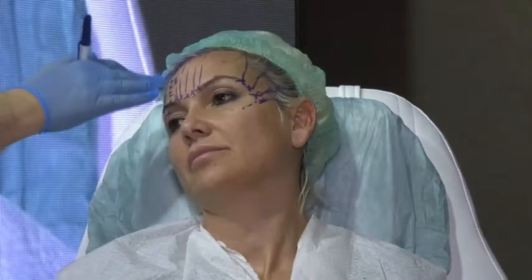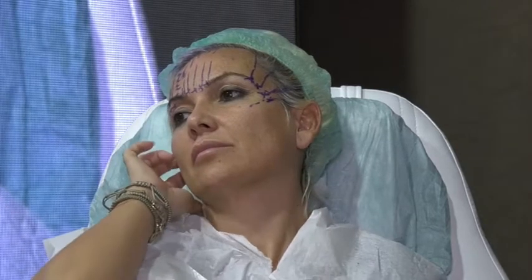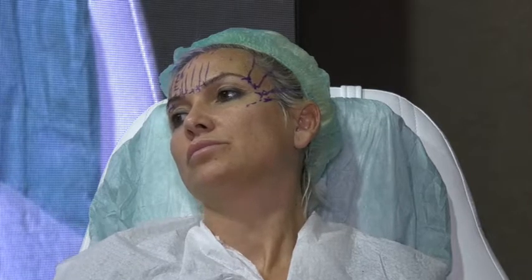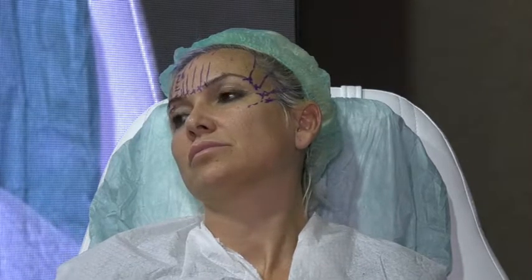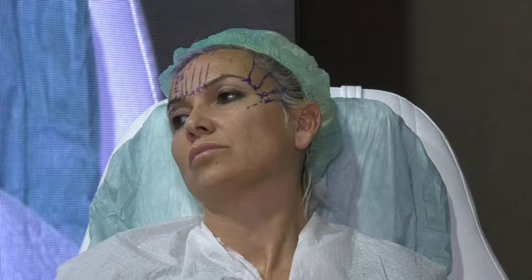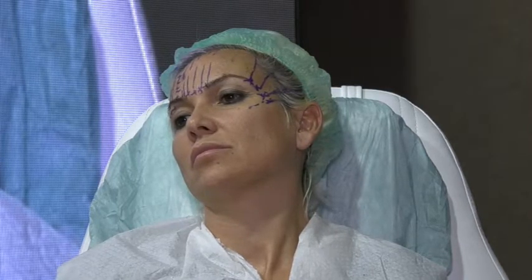So, you can do it going from down like that. Start with 1, just straight at the lateral part of the eyebrow. To the lateral part of the eyebrow, go straight. When you go more, a little angle. When you go more, more angle. When you go more, more angle. So we'll have what we call the sun rays technique. It's like that. Okay? Everybody is going in its own way, out. Okay? It's clear?